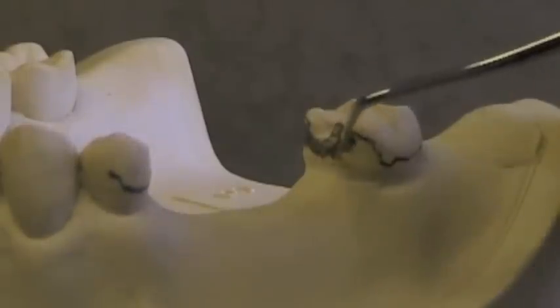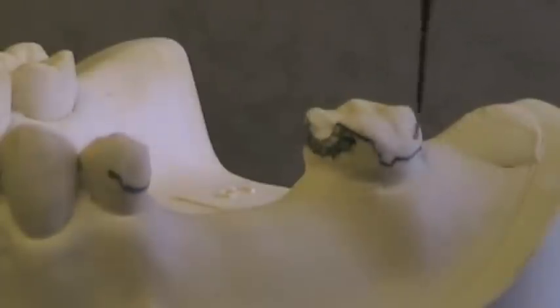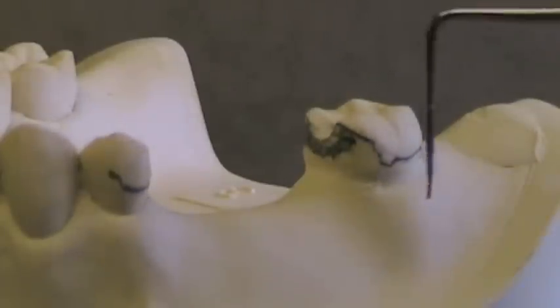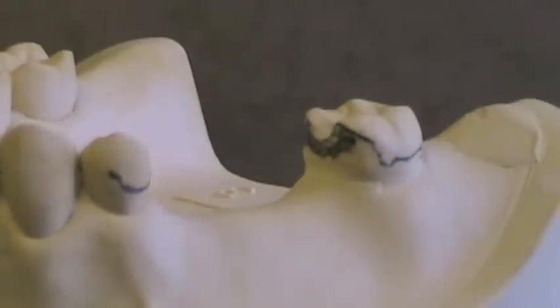For tooth-borne cases, this is what we'd like to see — longer guide planes. There's not as much rotation on a Class 3 or Class 4 tooth-borne removable partial denture, so those can have very large guide planes without causing torquing of the teeth.